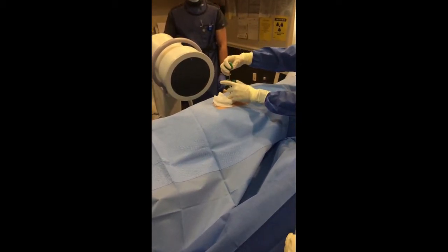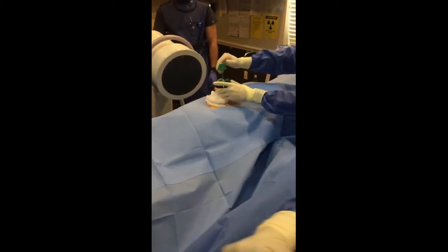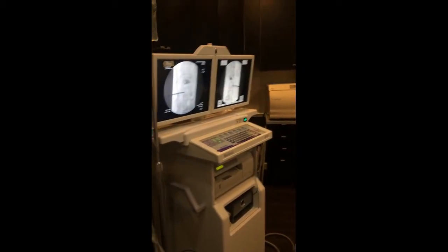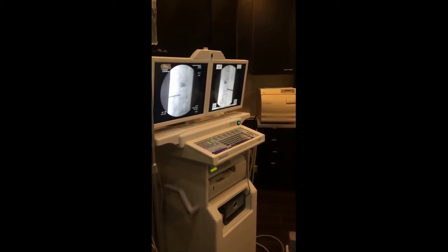You'll see on the picture that the drill is now... No, not you, honey. You're doing great. You can see the drill that's there. So Dr. Chen, you're going to torque it that way a little bit and twist in one direction, clockwise, okay? Go ahead, give it a good twist. Very good, let's take a picture.